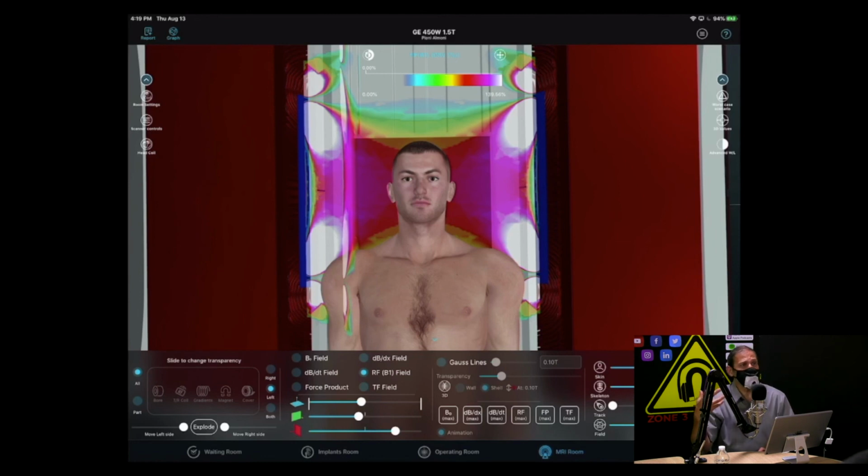And that's the concept that we're trying to get across, that understanding MR safety is a science. It's truly a science. Those physicians, those technologists, those physicists that have dedicated themselves to actually becoming more knowledgeable, more experienced, more capable in this area, hats off to them. They've literally decided that they're going to turn this into a profession, not just button pushing. Right. This is their profession. They truly want to earn the name technologists, understanding the science behind what they're doing so that they can do it safer and more efficiently.